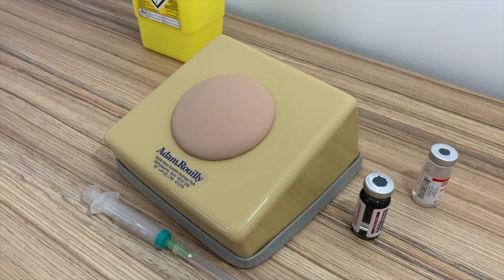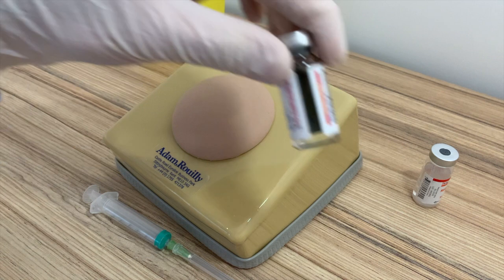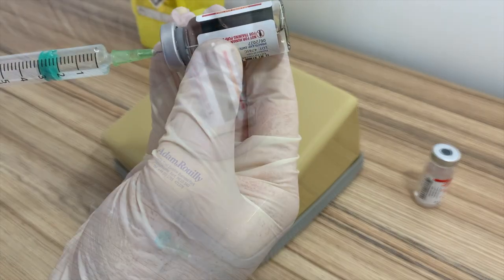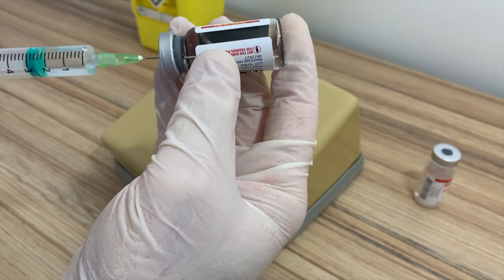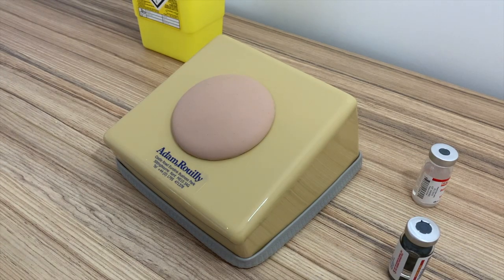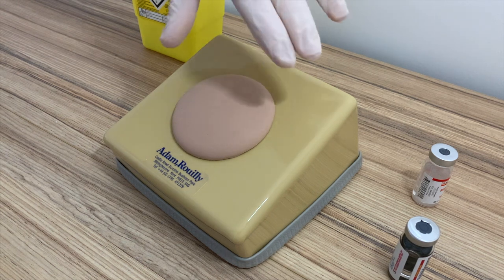I'm now going to perform an intramuscular injection using some practice vials, which is just water, which we'd recommend always using. I'm going to assume that this is the deltoid region of the patient's arm and administer the intramuscular injection into there.